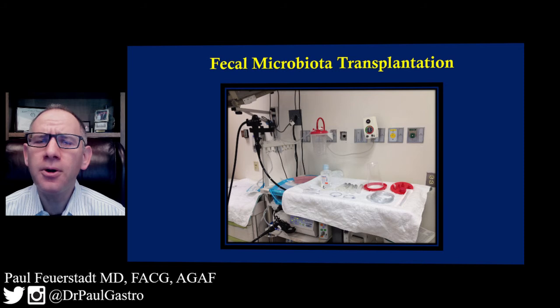Typically before the colonoscopy, Imodium is given as an antidiarrheal to the recipient. That will hopefully allow the recipient to hold the matter that was put into their bowel longer than if they didn't receive this. At the end of the colonoscopy, the recipient is asked to hold the air and the fluid as long as possible.